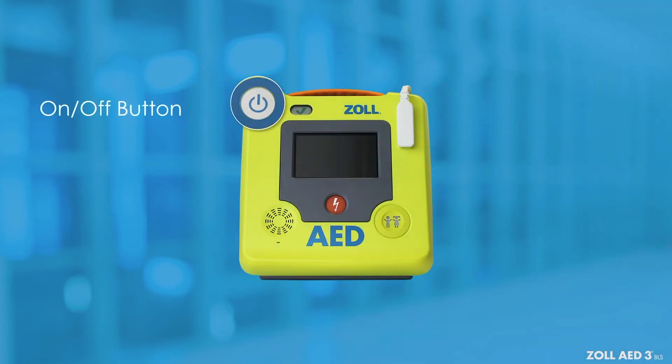Turn on the AED by pressing the ON-OFF button. The Zoll AED-3BLS will cycle through a series of audio and visual prompts.